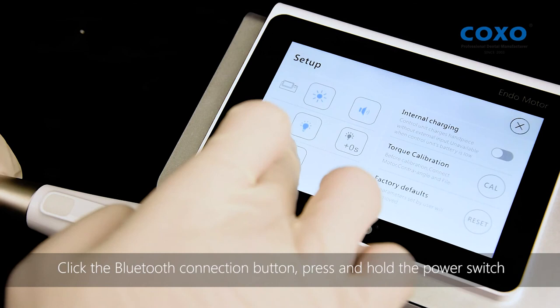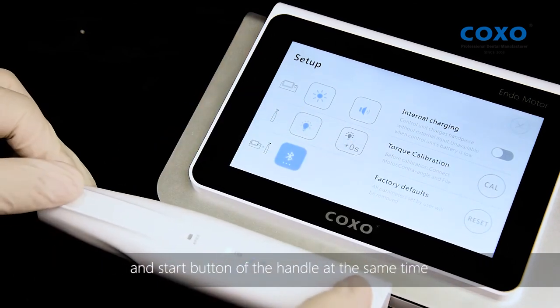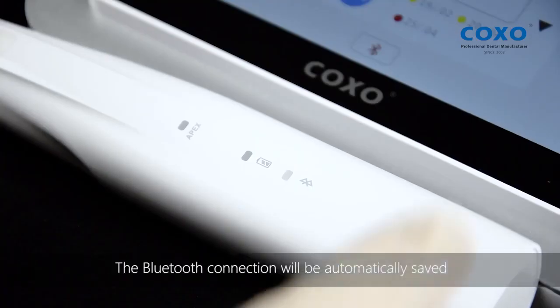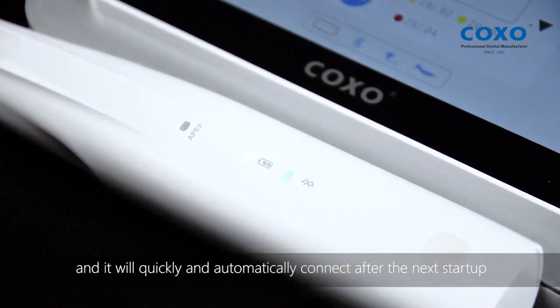Click the Bluetooth connection button, then press and hold the power switch and start button on the handle at the same time, until the Bluetooth indicator light is on. The Bluetooth will automatically connect. The Bluetooth connection will be automatically saved, and it will quickly and automatically connect after the next startup.